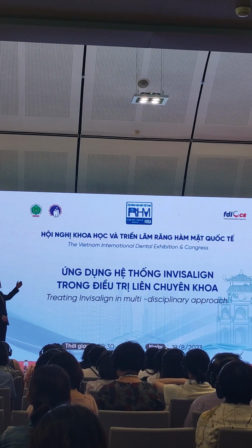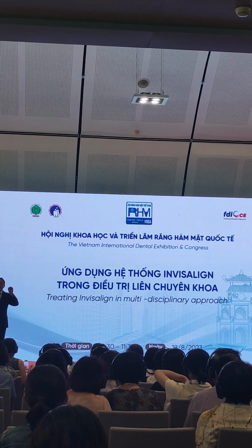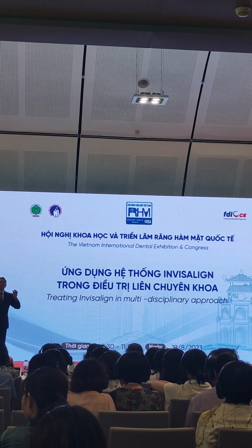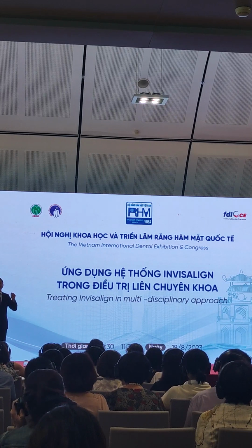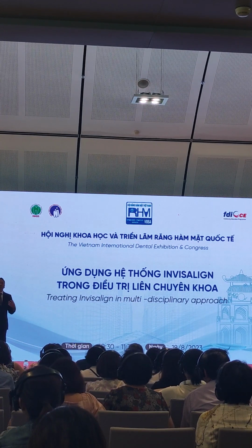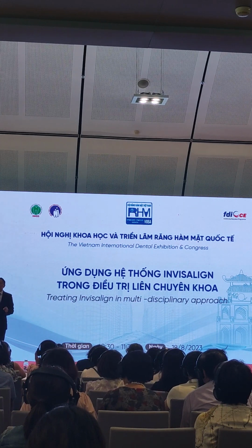When we talk about implantation, usually we have opposing over-erupted molars. As long as we open up some space for it, and we have retentive attachments on the adjacent teeth, the aligner can produce the force to intrude. Why do we need a mini screw? Sometimes it's for anchorage issues and to prevent any unwanted extrusion of other teeth. But the aligner covers the other teeth and also provides good anchorage control, so we can intrude molars without a mini screw. We do it always. But when we talk about intruding the whole segment, sometimes it's more difficult.